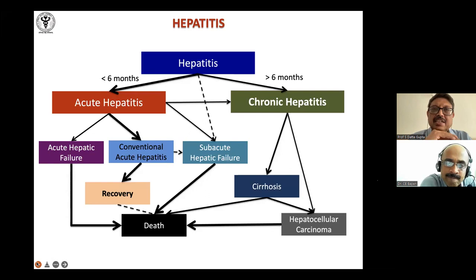See, liver biopsy, first you see under low power, we scan the entire slide. Then we begin seeing. There is no hard and fast rule, whether you start from the terminal hepatic venule end or you start from the portal end. Usually, because most of the time this is done for hepatitis, many start from the portal tract end and go to the terminal hepatic venule. Others, for example, if it's Budd-Chiari, or most of the changes are from the central area, you can start from the central and then go gradually.